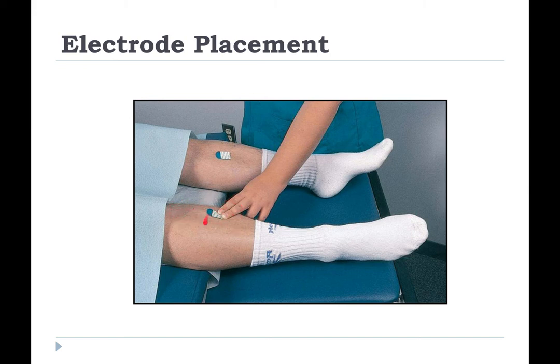So just medial of the shin bone on the most fleshy part. Also, if you can get it on the side here, they might have less hair to interfere.